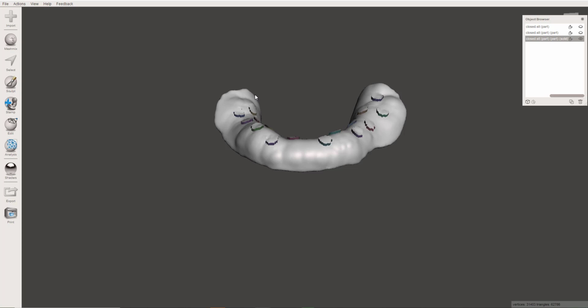The beauty of digital dentures, especially if you're printing them, you're looking at $7, $8, $10 something dollars a piece. So let's say that you went straight to final and you didn't love it. You're skipping the wax try-in here. So if you make this and you don't love it, we'll just make some notes of the changes that need to be done. Maybe you equilibrate the bite in a little bit more, and then just go back and make those changes in the software. So that could be a wax try-in, and then you deliver on the last appointment.